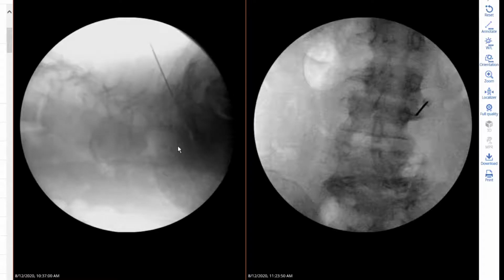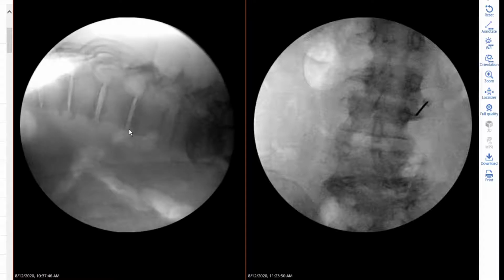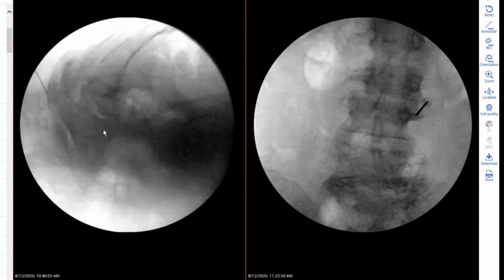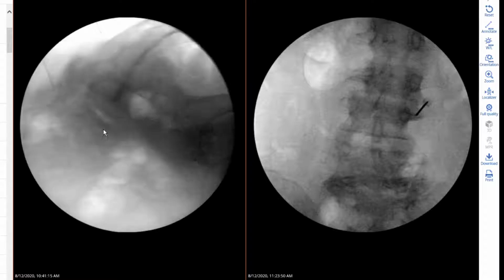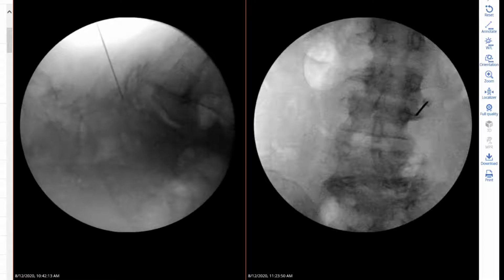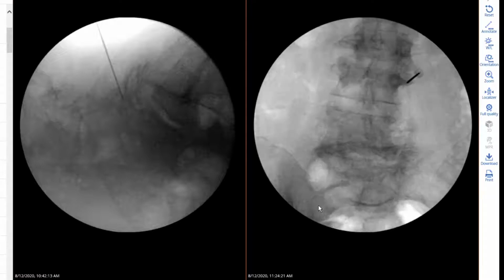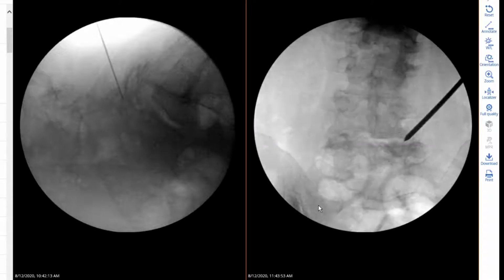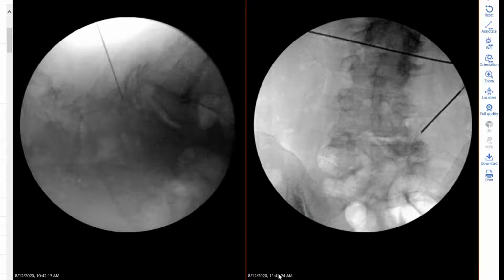Here you see that practically even if you concentrate on one disc, the other discs and pedicles are out of focus. And here, after 10 minutes or so working on the proper imaging, finally I decide that for L5-S1, this is the proper kind of imaging that would give me access to L5-S1. At this time, the time is 10:42, so I'm going to advance this picture. As you see, I spent almost 20 minutes to familiarize myself with the proper setting that would get us there. And here we are at 11:42. This C-arm still has the winter time, so they're just offset by 1 hour.